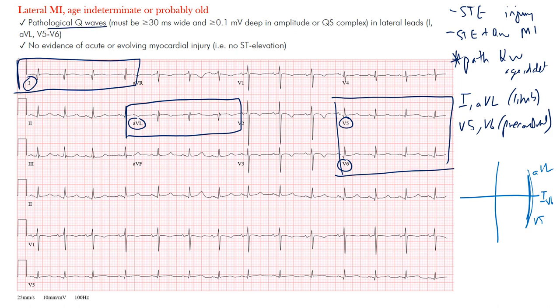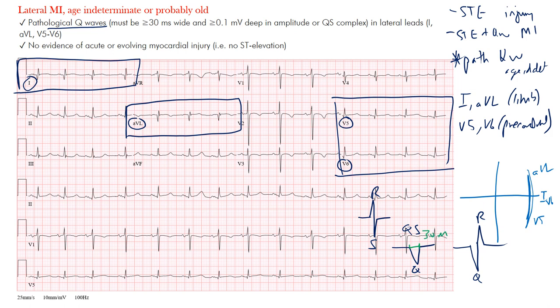We're looking for pathological Q waves. The Q wave is the first negative deflection of the QRS complex that precedes the R wave. Maybe there's no R wave present, but it has to come before it, or it has to be absent. You cannot have a complex where an S wave follows an R wave and call that a Q wave. It has to always come before the R wave, or you may have a complex with only a Q wave present — called a QS complex. What we want to see are wide Q waves: at least 30 milliseconds wide and at least one millimeter deep.